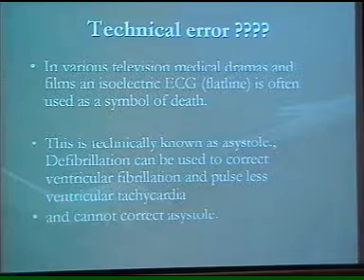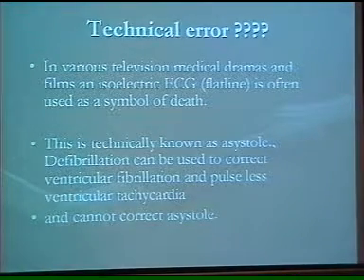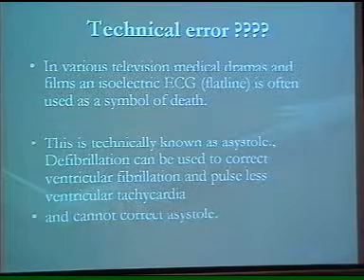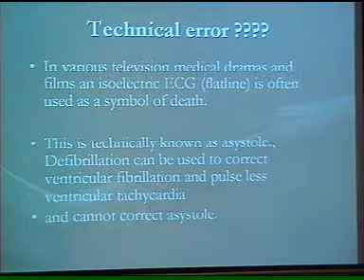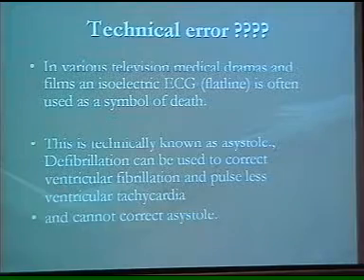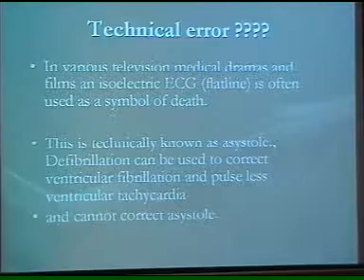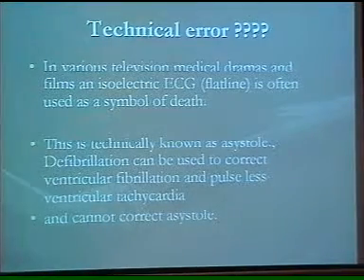And then you have also seen that when the line goes flat, people are defibrillating the patient. It's very common, it's seen to create drama. So the error is that defibrillation is used for fibrillation and pulseless tachycardia, and asystole, the flat line, is not reverted by defibrillation.